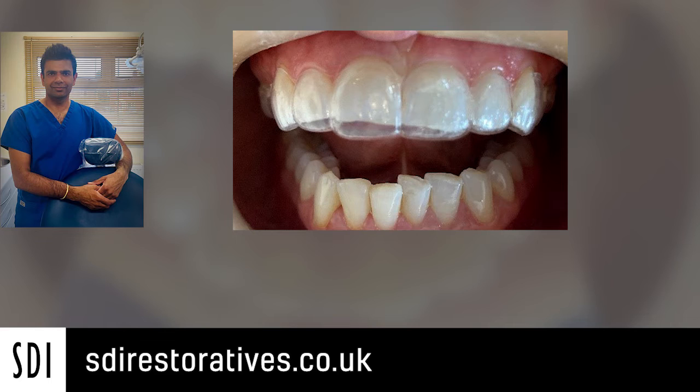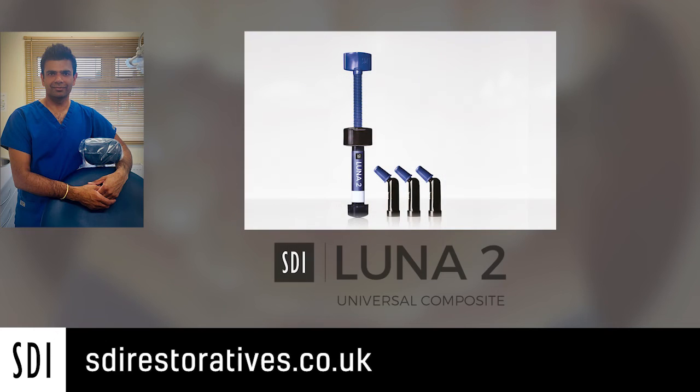At her appointment we took a shade pre-operatively and it was shade B1, and we went for LUNA2 composite because it has excellent handling due to the filler composition. It doesn't slump, it's easy to handle, it's durable and it produces excellent aesthetics. Because this was a simple incisal build-up, a single shade was actually appropriate and it came out as shade B1.